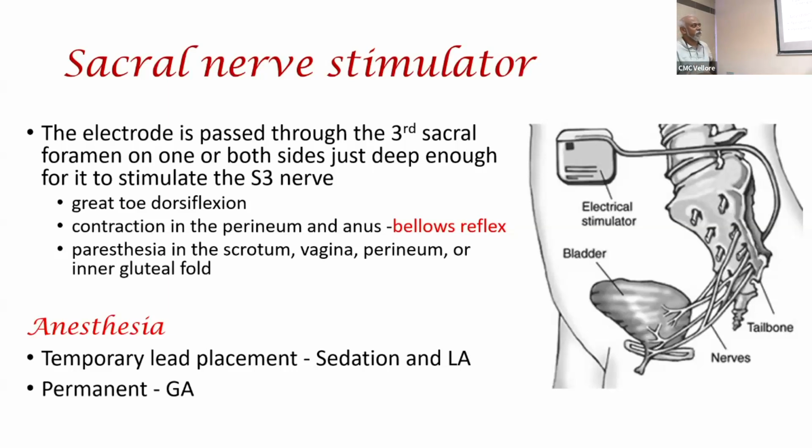So actually, when they put in the temporary lead, you need to get the patient awake. They need sedation and local anesthesia. But when you're finally putting in the generator, you can give general anesthesia and implant. This is being used quite a bit for incontinence and this.